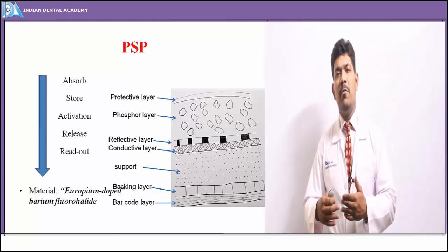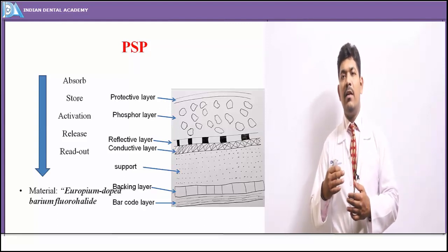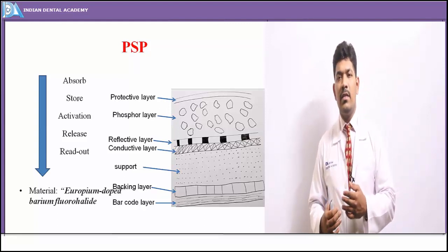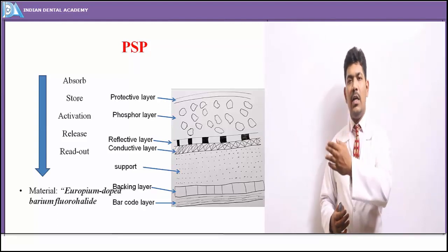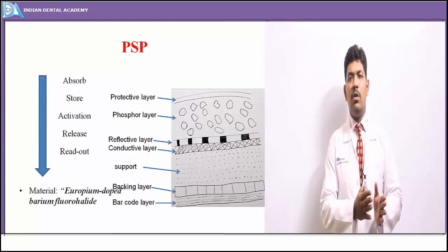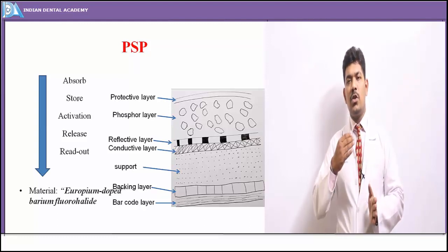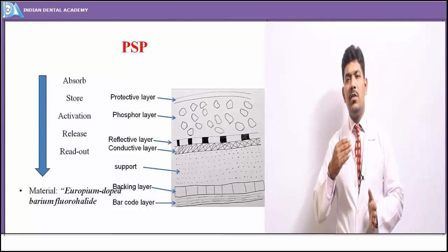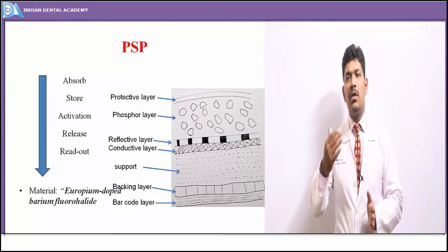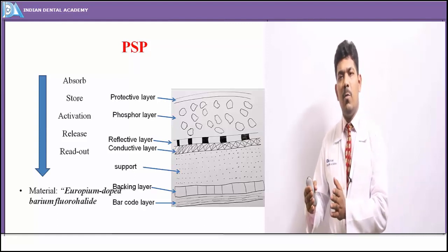It is released via light of a different wavelength than which was incident upon it. Say we are stimulating this kind of sensor with one X kind of wavelength. Now upon stimulation, the energy which is stored on a temporary basis within the sensor is given out as light again of a different kind of wavelength, say about Y wavelength.